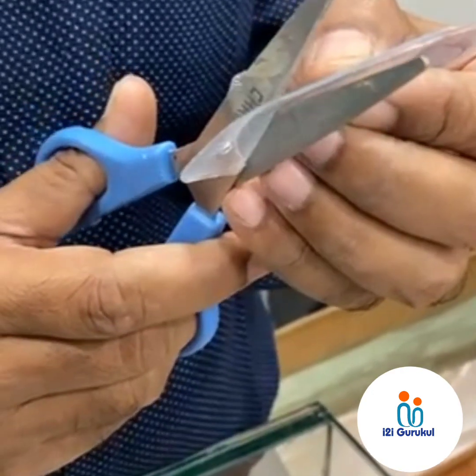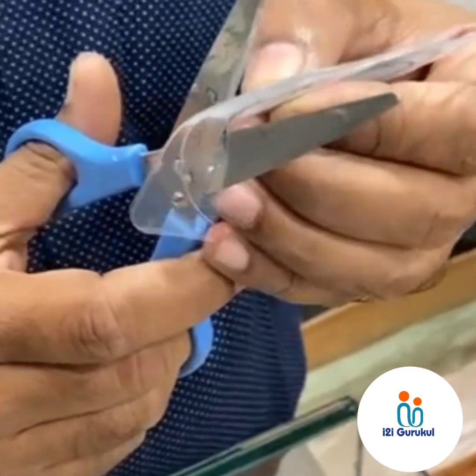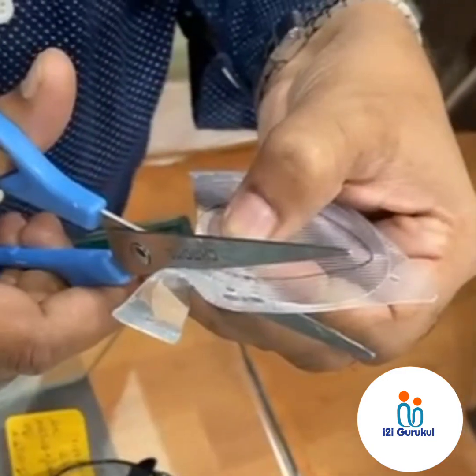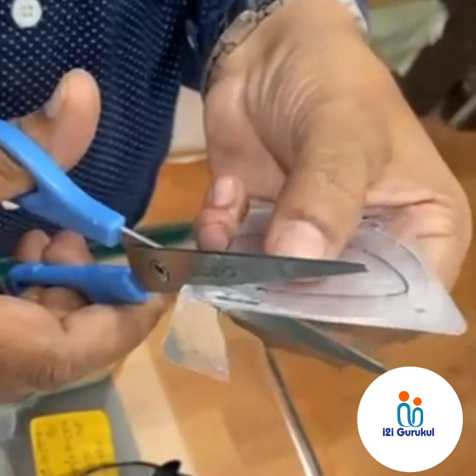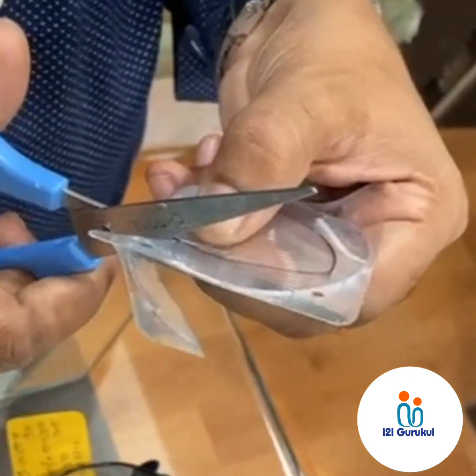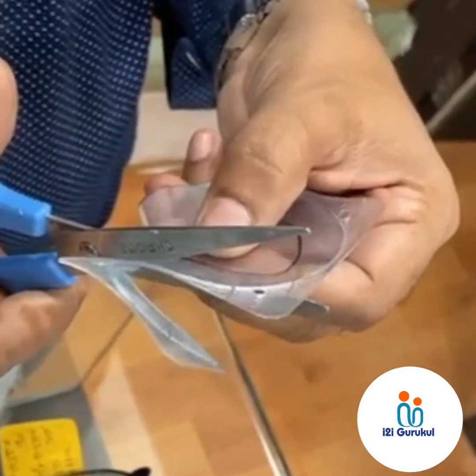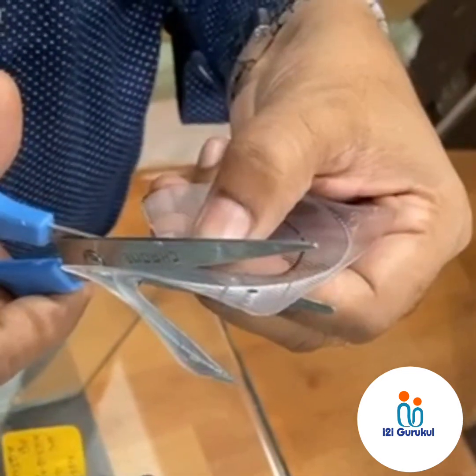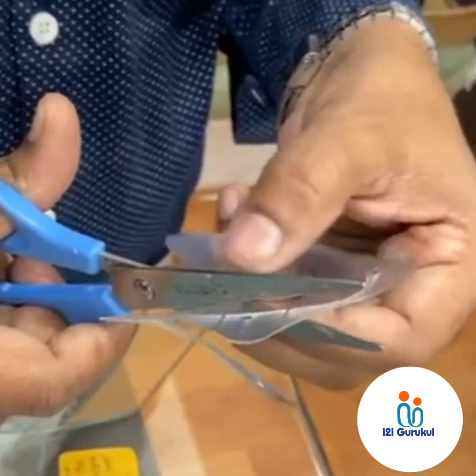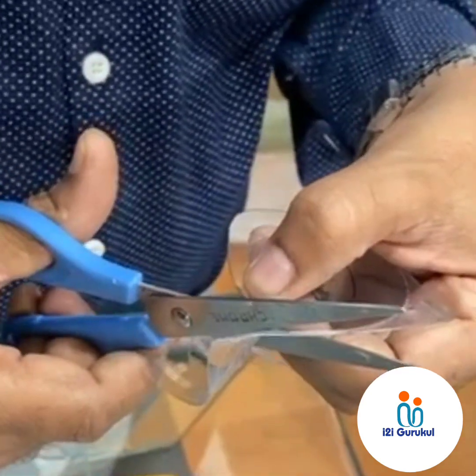For cutting the Fresnel prism, please use a sharp scissor and maintain your cutting inside the marking. Also keep in mind that the edges of the Fresnel prism must be in a regular shape — it should not be irregular — so that it will fix easily on your spectacle lens. Irregular edges can cause elevation at the border, which can trap air bubbles, and your Fresnel prism will not fix properly.